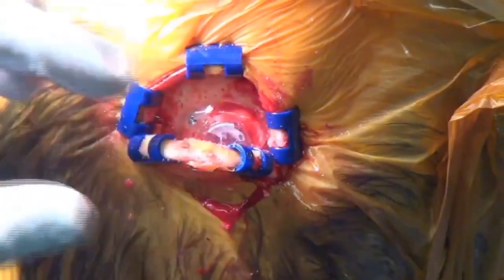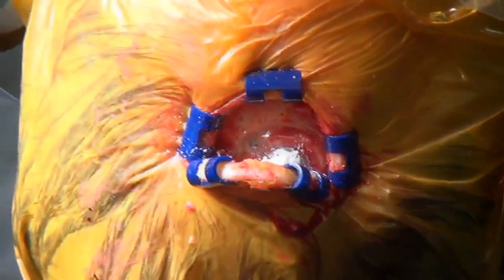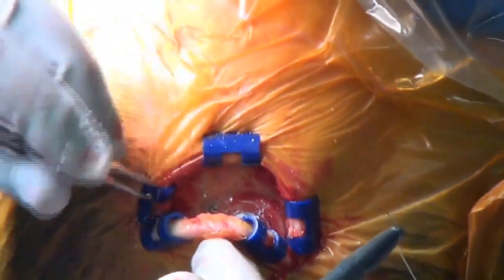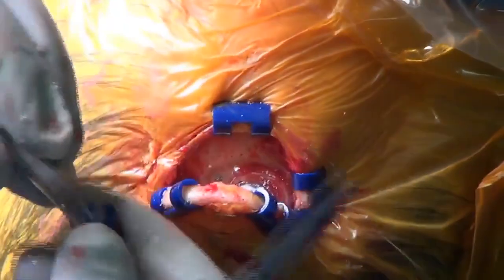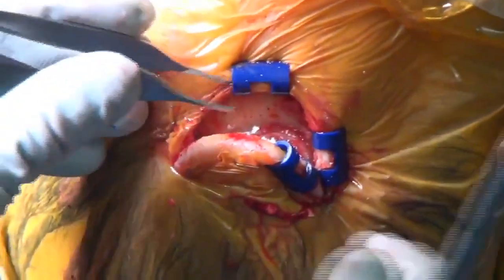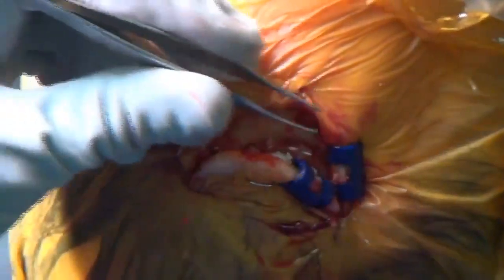Nice, healthy scalp. Okay. All right. And that's it. We're ready to close. So we're going to be using our little 4-0 Vicryls. Sometimes we'll see some bleeding at this point. Yep, fire away.